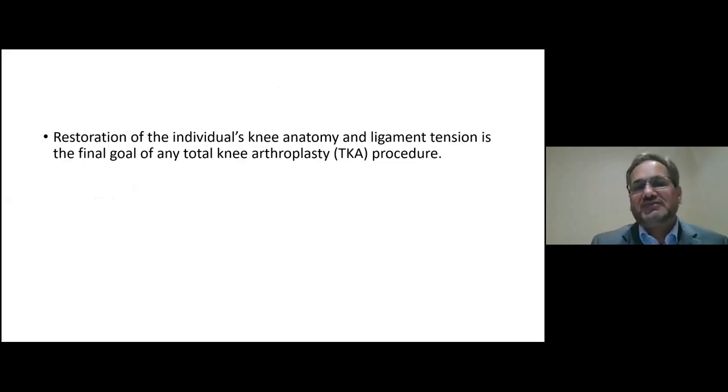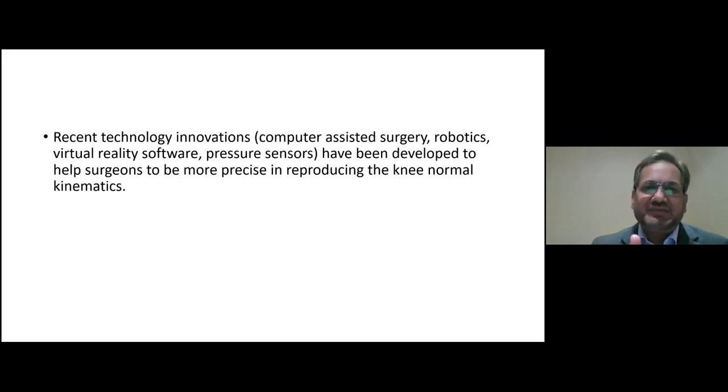is that the patient should be pain-free and should have restoration of the function of the knee. Well, how can we achieve that? Basically, we need to achieve the proper anatomy and the ligament tension in the knee arthroplasty. There are a few other things, which I think need a separate lecture: computer assisted surgery, robotics, virtual reality software, pressure sensors. I just put that so you know that there are a few other things in knee replacement as well.